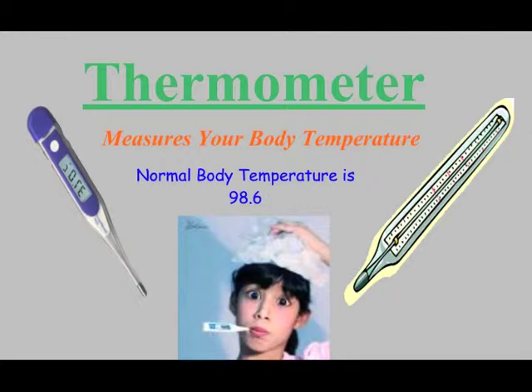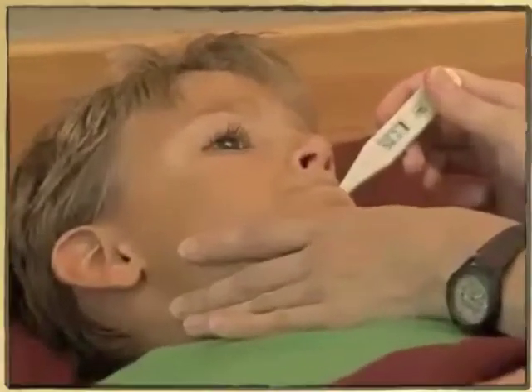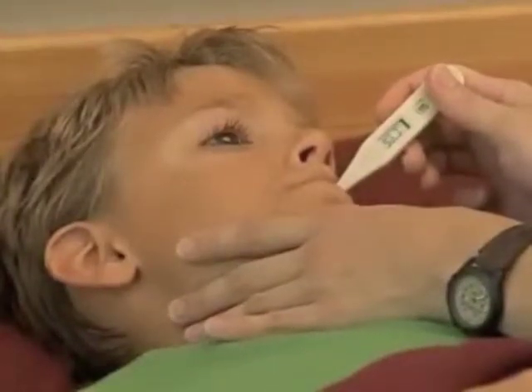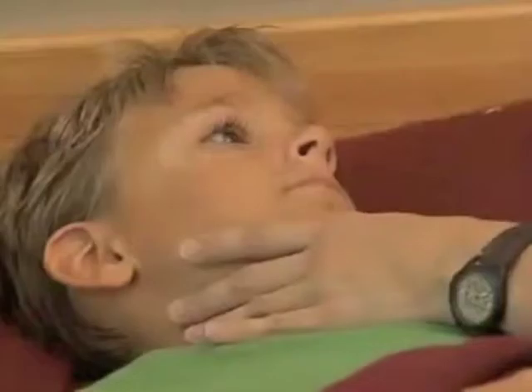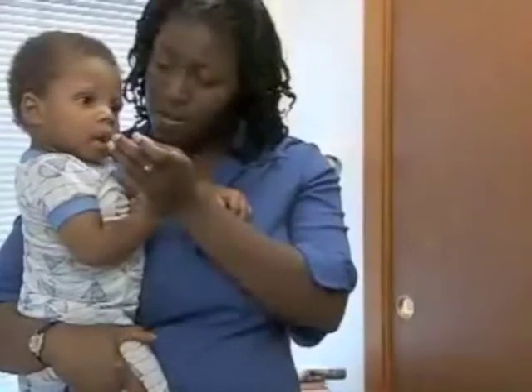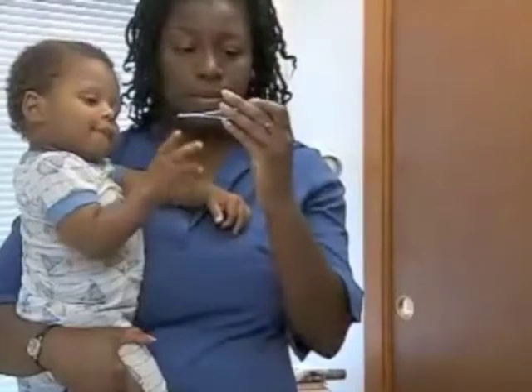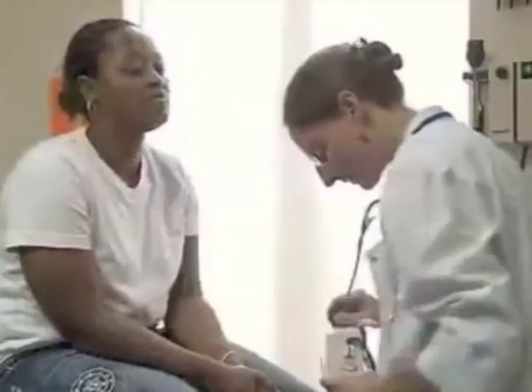All right, so a lot of times when you go get a checkup, they will test your body temperature by using this tool called the thermometer. With the thermometer, guys, you have to make sure you're sitting still like this little boy is. He's staying still. He's letting the person take his temperature. You can even do it with little kids. Adults also get their temperature taken too. Watch this one adult. She's patient, she's staying still, and she lets them take their temperature.